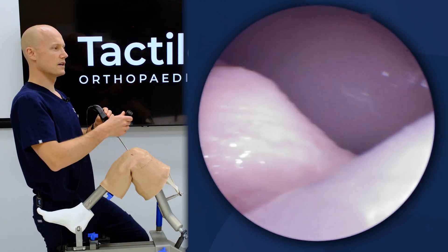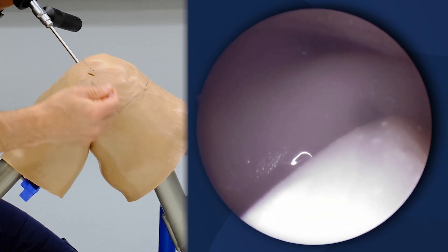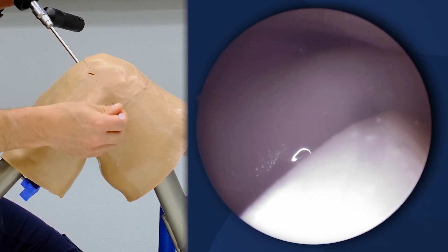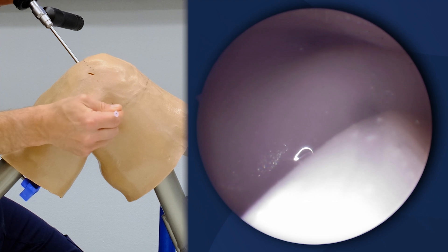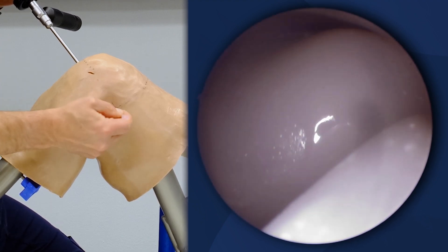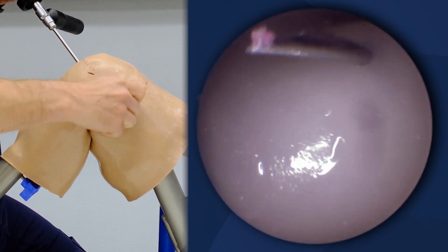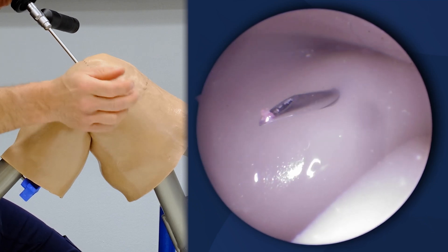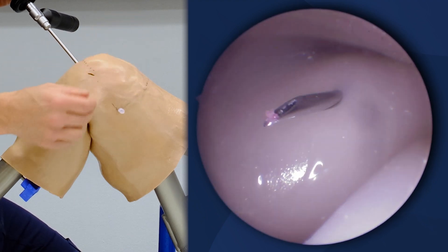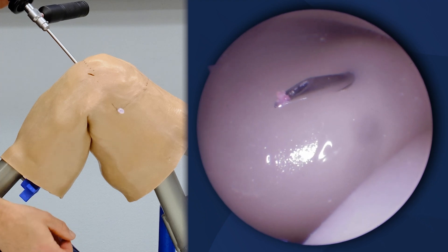There are folds in the back of the knee, but this is where we gain access. I'm going to stay within my Langer's lines and the meeting point, and the localization of that portal is quite accurate. Staying straight and flush with the needle at the interface of those two Langer's lines shows a pretty easy access to the posterior compartment.